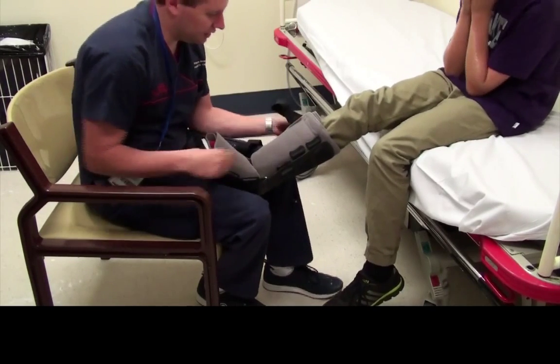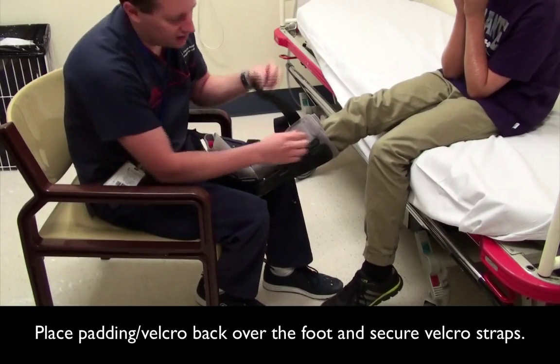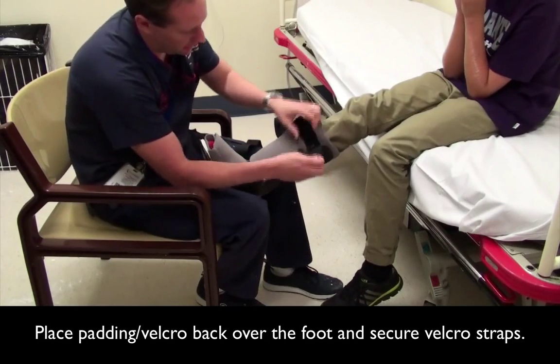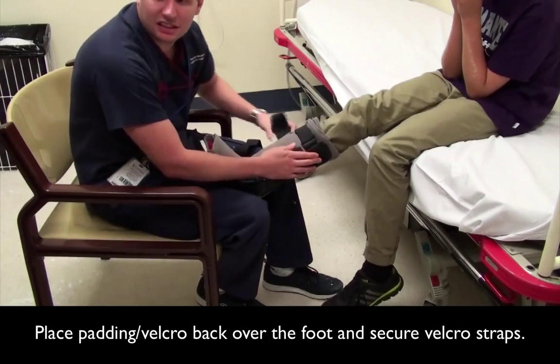Place padding over the foot and close the velcro straps. Some boots do have an extra piece of padding sewn in, which goes over the foot.